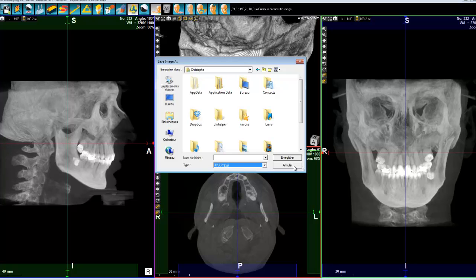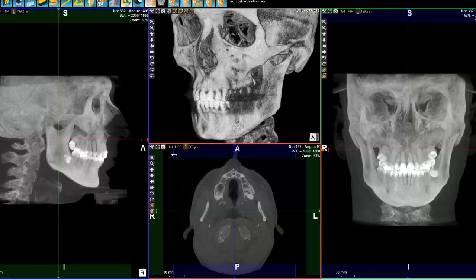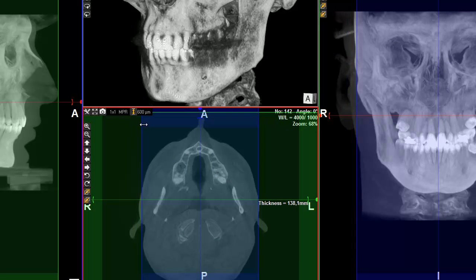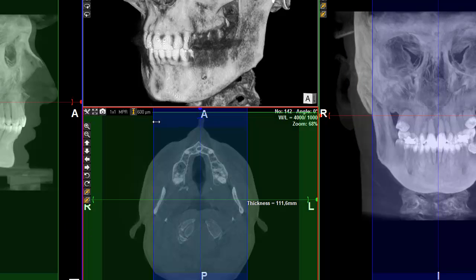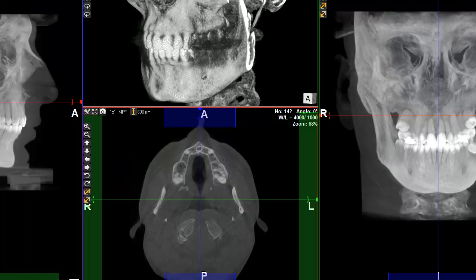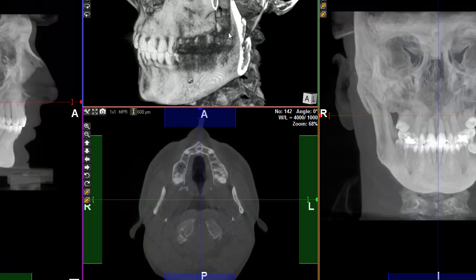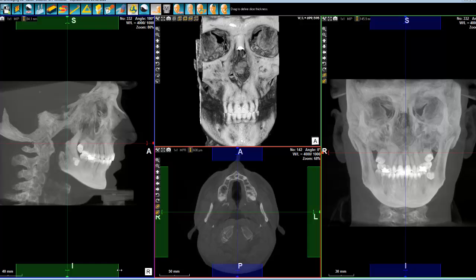We also have the possibility to select only an area, which has the advantage of erasing some part of the anatomy of the patient. We can do that in all views, but then the volume here gets a little bit uninteresting — so let's put it back.